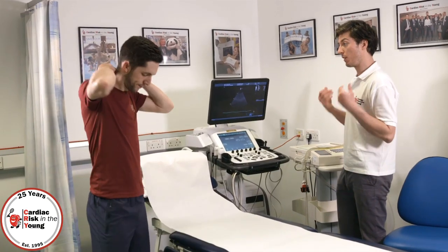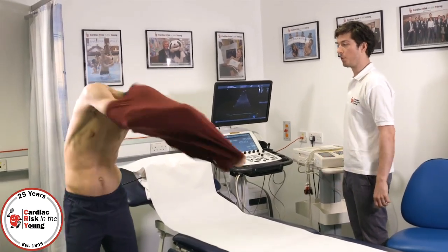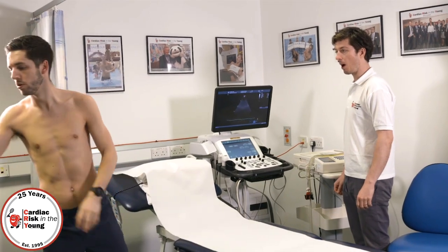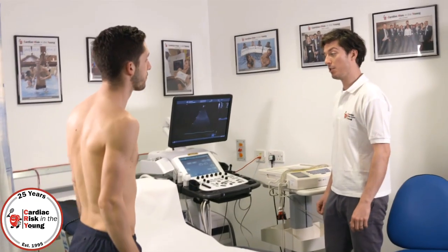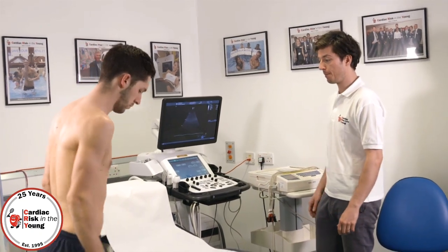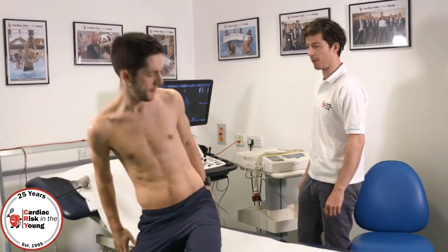Come on in, Ben. So I'll get you to take everything off the top half. You can leave your shoes on. And the first test we're going to be doing is the electrical tracing of the heart, the ECG. So I'll get you to lay on your back here, facing upwards. Shoes are fine.